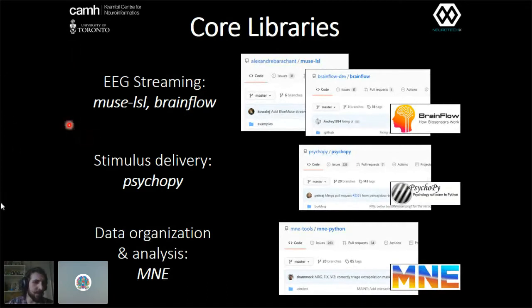And then the second stage, I mean, we're doing this concurrently, but the second component is run an experiment. I've mentioned cognitive neuroscience experiments before. By the way, you can take one or other perspective or both perspectives on what we're doing here. My perspective, a function of my background, really, is that we're doing cognitive neuroscience here, but some of the neuroengineering community tends to think about things more in terms of brain-computer interfaces. There's obviously no sharp line between those two, although there might be a continuum. But yeah, so stimulus delivery, call it cognitive neuroscience or call it BCI, whatever you like.